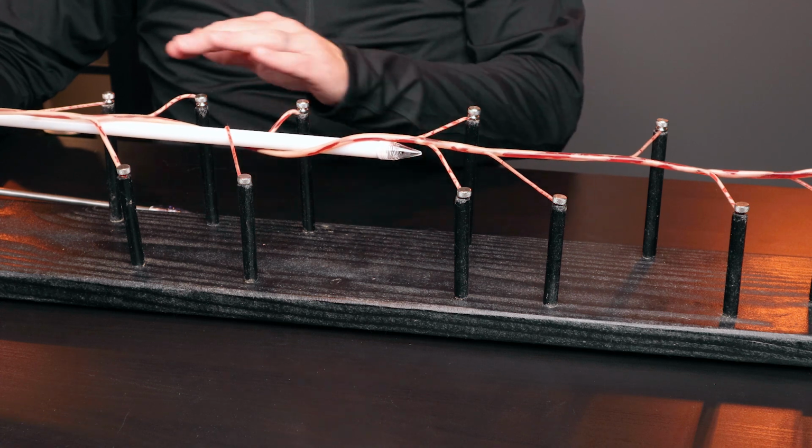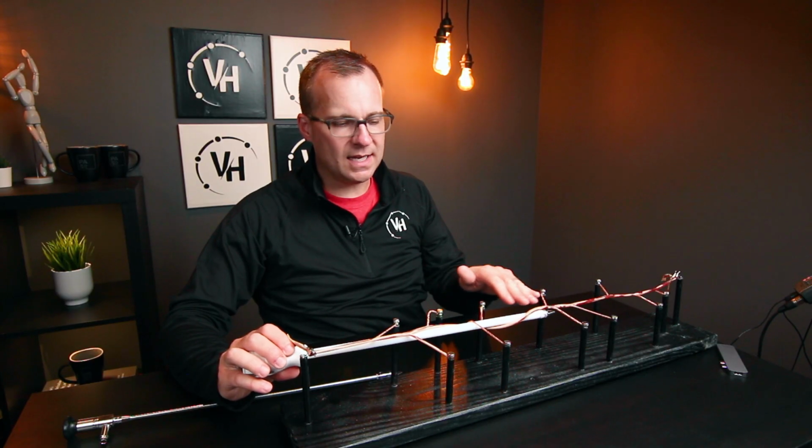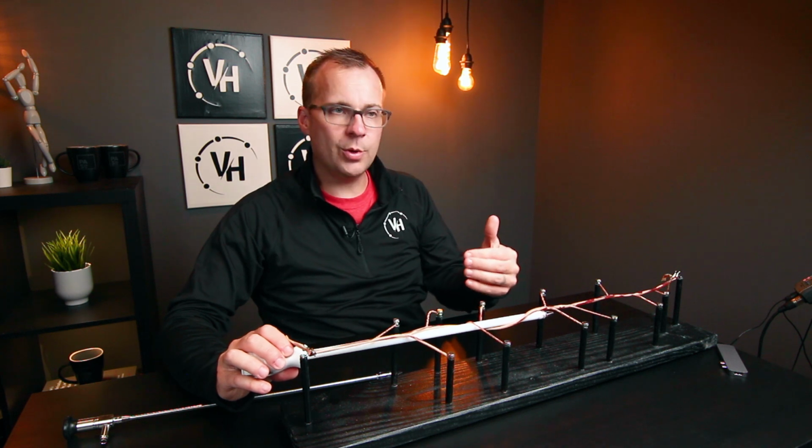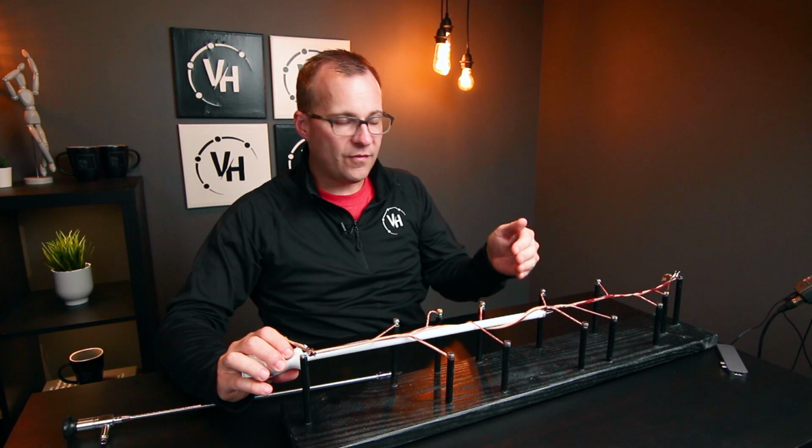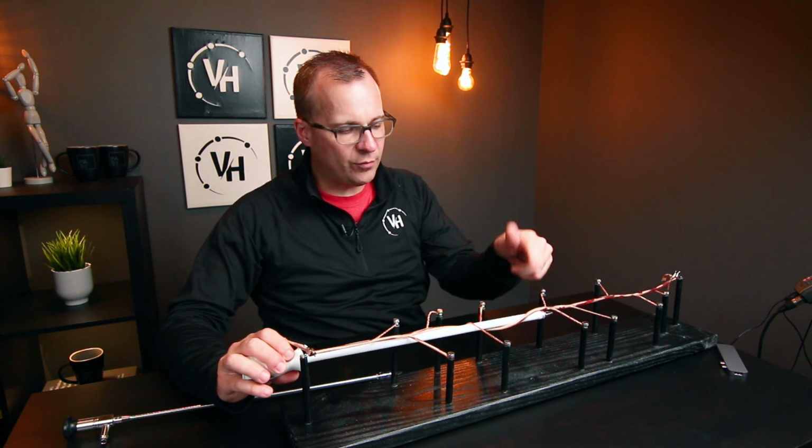my dissector. And even though it slides nice and easy, that's unnecessary tension that you're putting on the bifurcations of where these branches are. These are tethered points for the saphenous itself. So if we've wrapped it all around in there and we keep going, we run the risk of avulsing those branches off. Not to mention, we're going to leave a lot of connective tissue undissected.